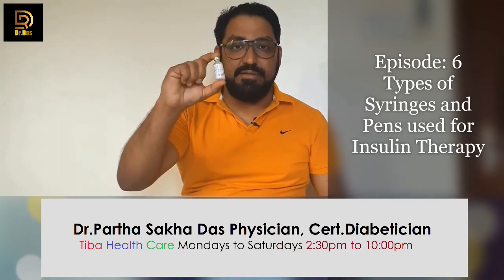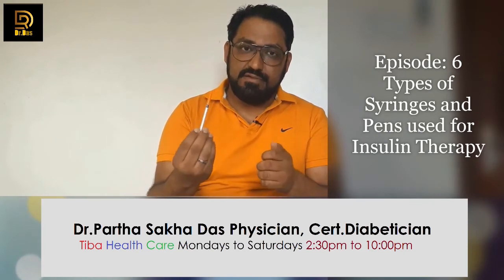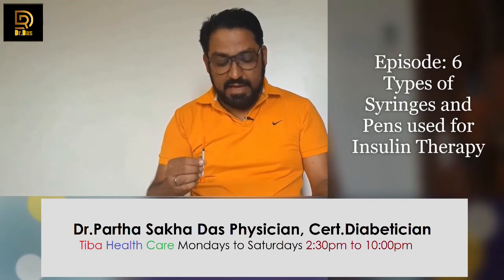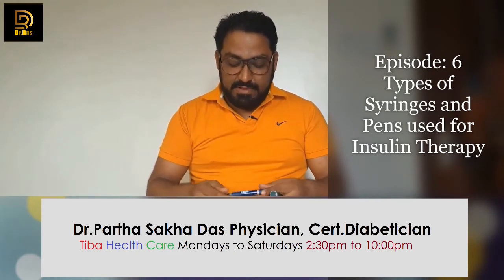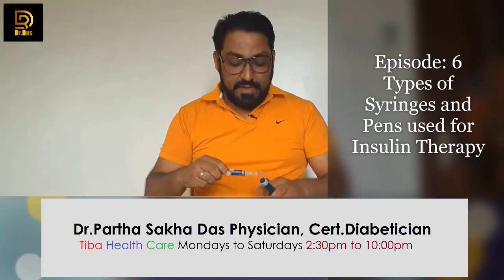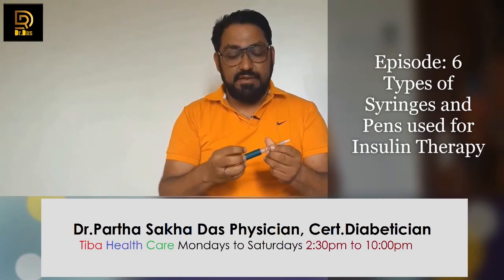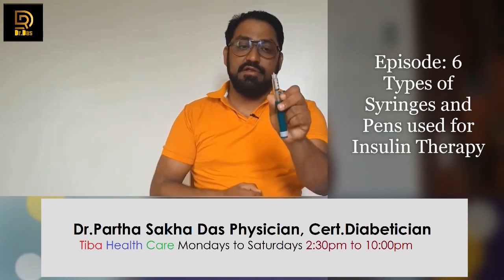To inject with this one, there are vials available like that. So you take the syringe, draw the amount of insulin you need, and then inject it into the body. Now both are available in the market, this needle and these pens. In these pens there is also the use and throw type, which doesn't open. And there is also a pen which you can open, refill the insulin, and reuse. If you see, the needle is very thin.